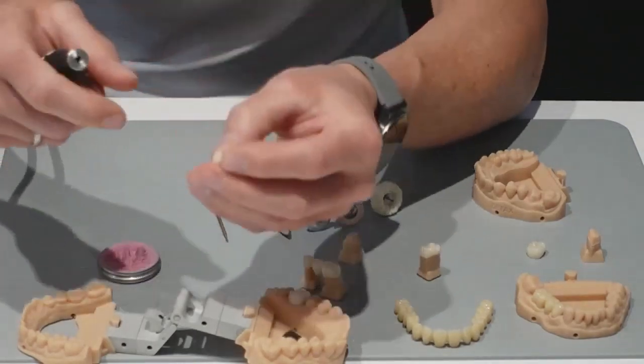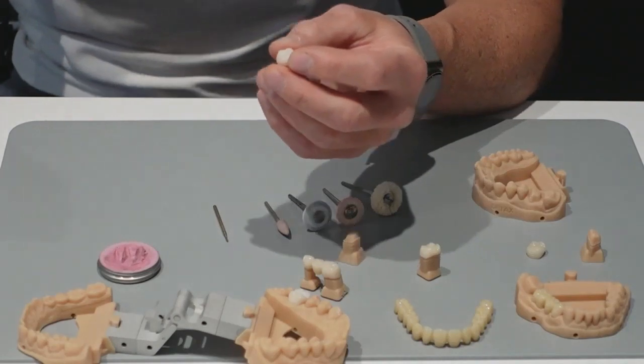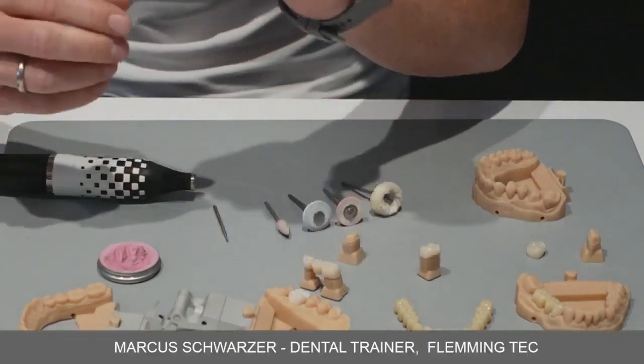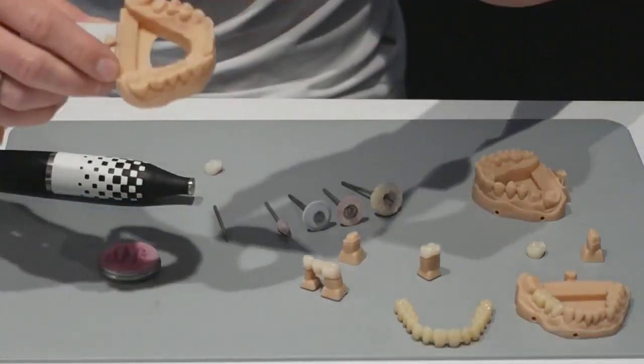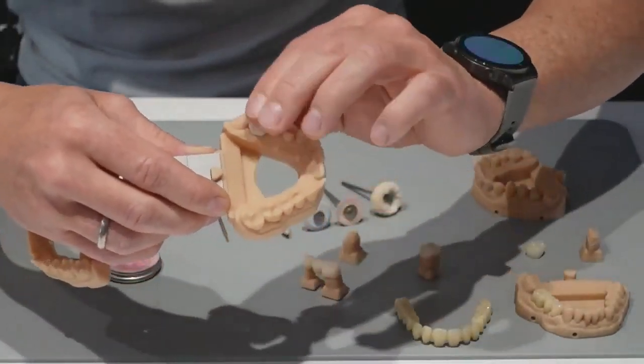What I have to say for this case is really this crown, which we have to design before in the design software. The result comes here directly from the printer, and we can set this printed crown directly on the model.